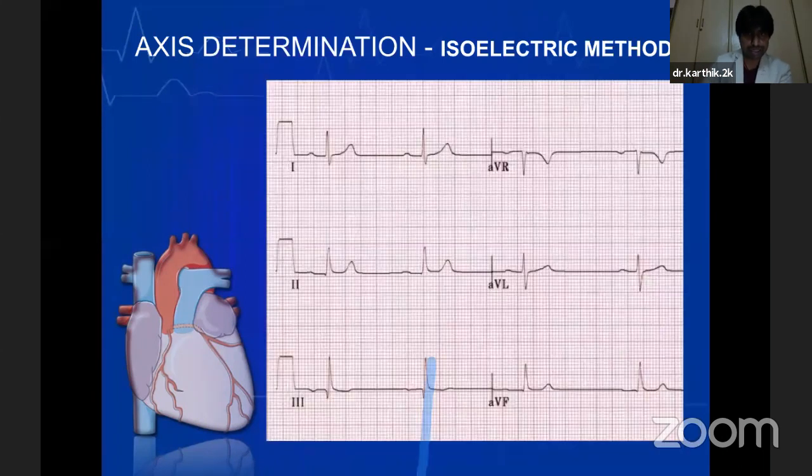You would be able to understand these things better if I show you the illustrations here. So in this ECG, you can use two techniques. You can use lead 1 and lead AVF, and you can naturally determine the axis. You can see that in lead 1, the R wave is positive, the net QRS is positive. That is, the height of the R wave is more than the depth of the S wave, so the net QRS is positive. In lead AVF also, it is predominantly positive. So at a glance, by the first method, I know that the axis is normal. It is between 0 to 90 degrees.